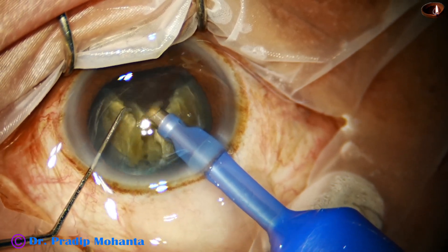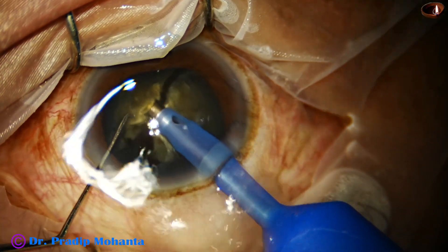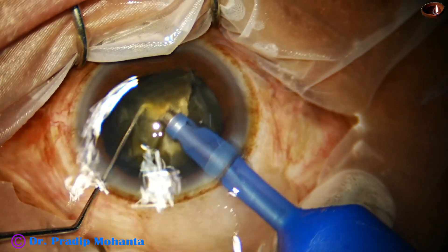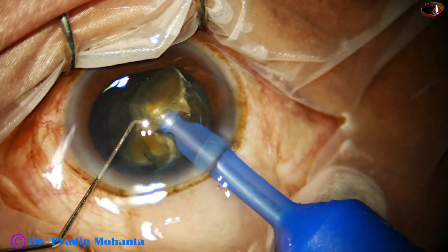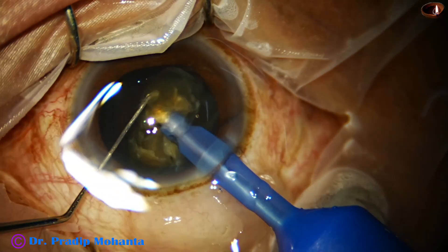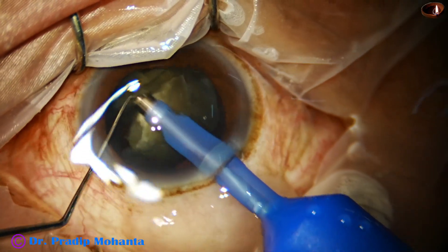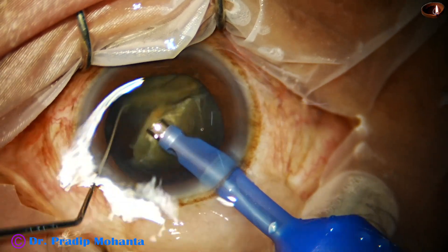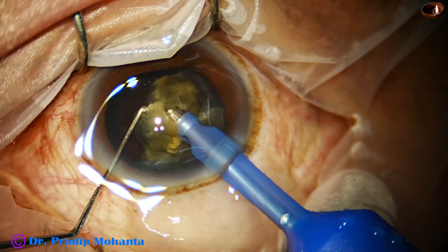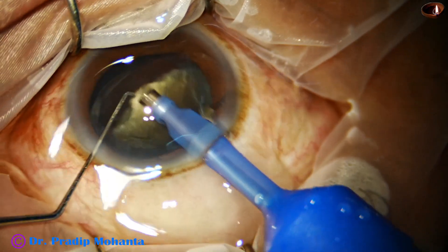We have to remain far away from the corneal endothelium, and we have to apply the energy intermittently. In between, we have to give a gap of one or two seconds, a very small period of time. So, the one hemi-nucleus has been managed by this time.